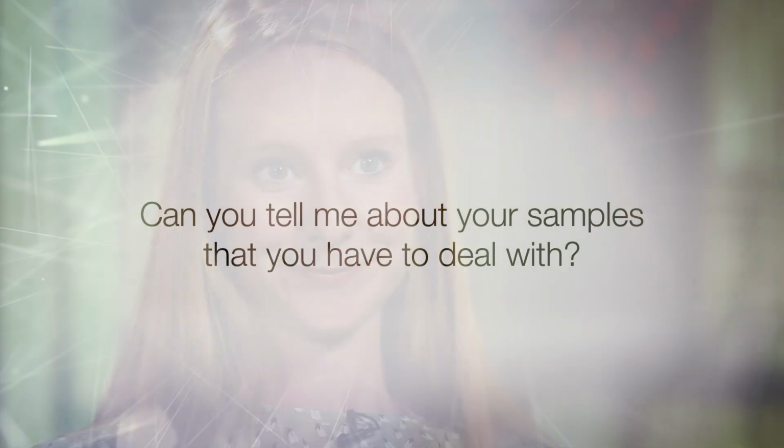Yeah, so 1,000 samples a week is based on having one of everything. So one Biomek robot platform and one Ion Chef and one S5 sequencer. So if you double those machines, that means you could double your capacity. So you'd be doing 2,000 samples per week, for example.